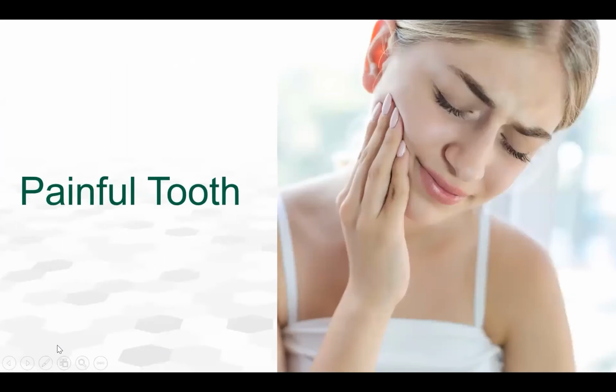The second application we're going to discuss is using T-Scan Novus Core to help rule in or rule out occlusion on a common problem of patients coming in with a painful tooth. So in preparation for this webinar, Alyssa and I were talking, and she actually brought up that her sister recently went through this sort of problem where she had a restoration done and she had pain and sensitivity on that particular tooth and wound up going back in 4 or 5 times to her doctor's office until they could fix it. So that's just a common problem that we see.